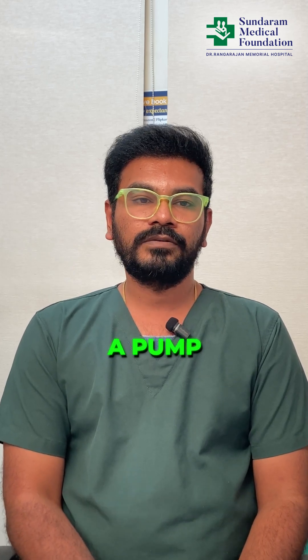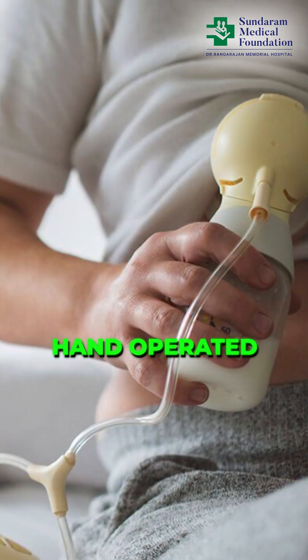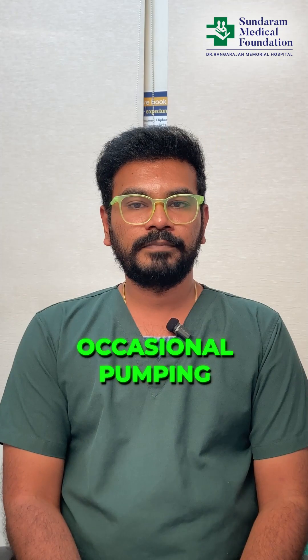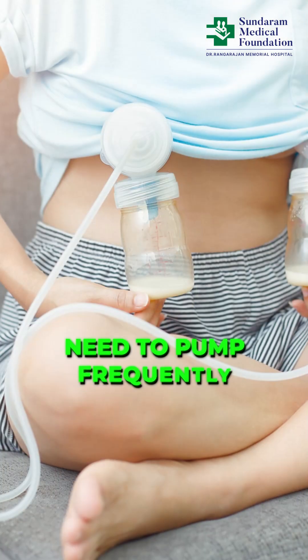Let's start with pumping. You can use your hands to express or use a pump. There are two types of pumps: manual and electric. Manual pumps are hand-operated and can be a good option for occasional pumping. Electric pumps, on the other hand, are more efficient and can save time, especially if you need to pump frequently.